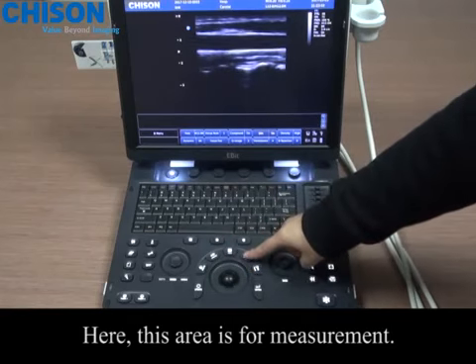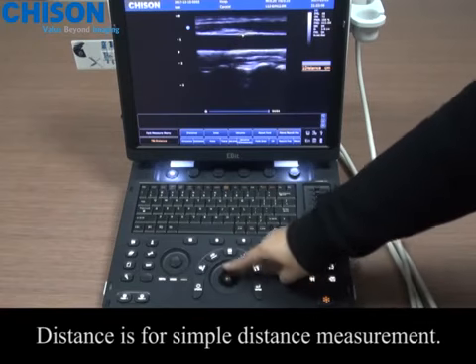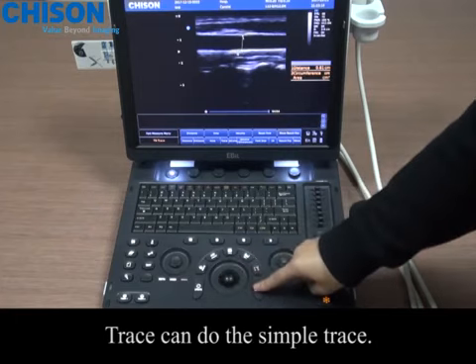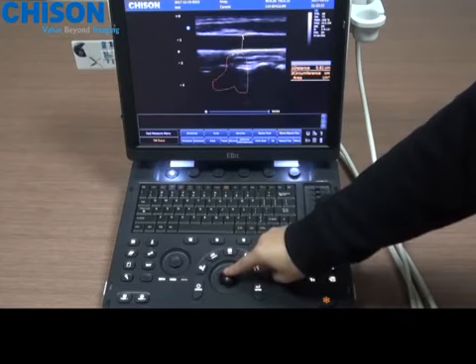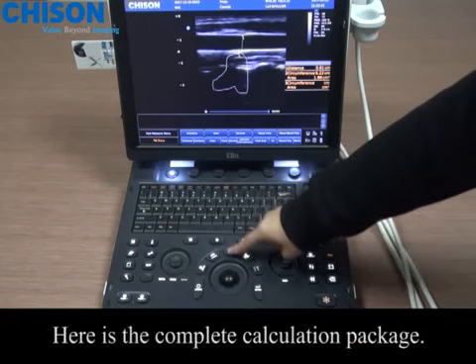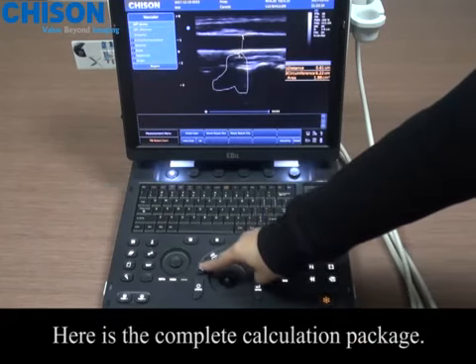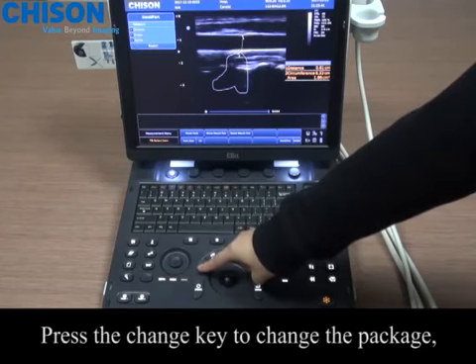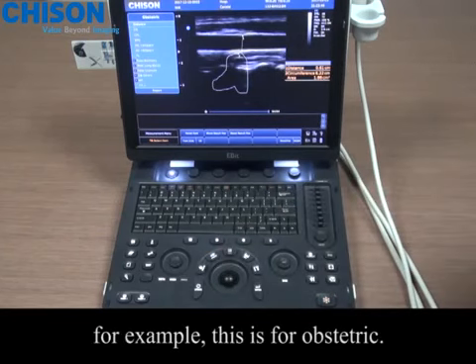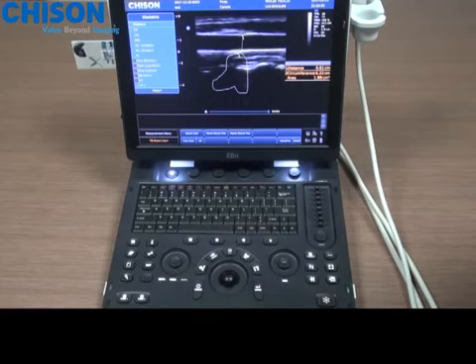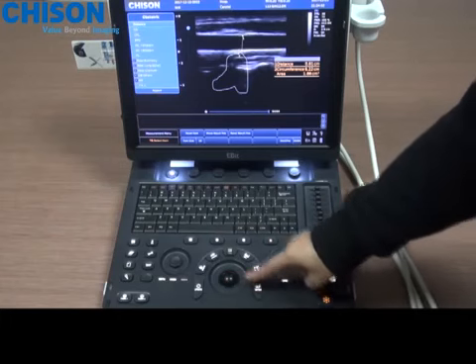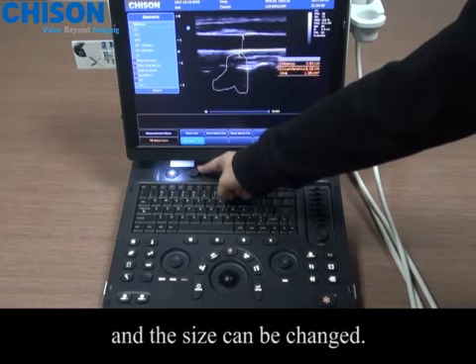This area is for measurement. Distance is for simple distance measurement. Trends can do simple traces. Here is the complete calculation package. Press the change key to change the package — for example, this is for obstetrics. The results can be moved and the size can be changed.